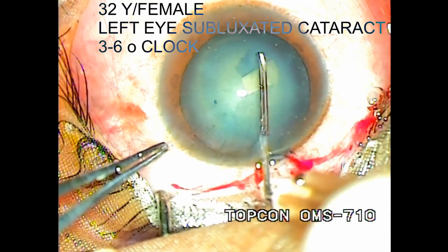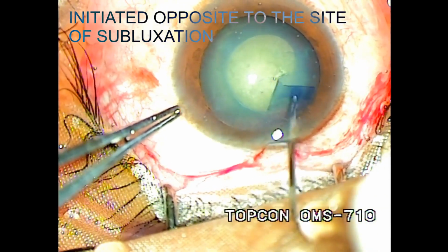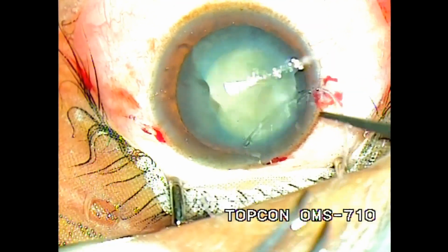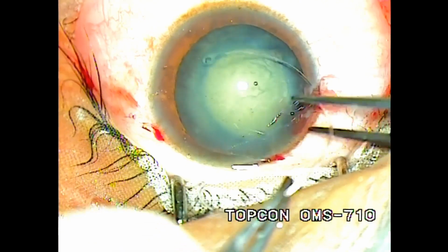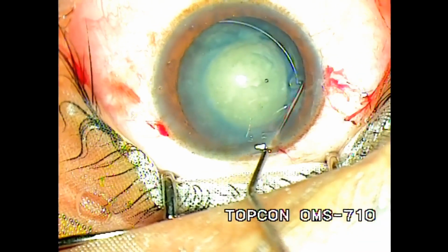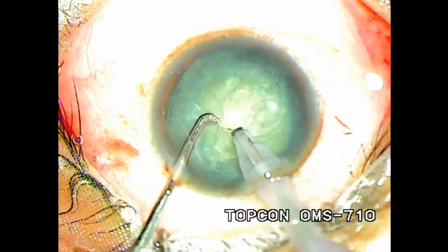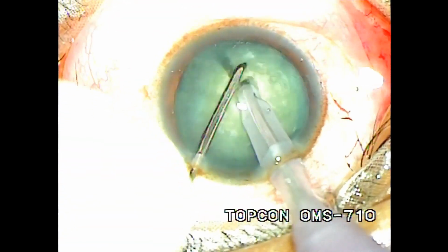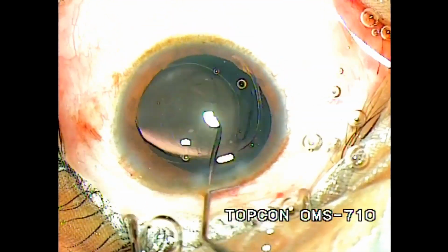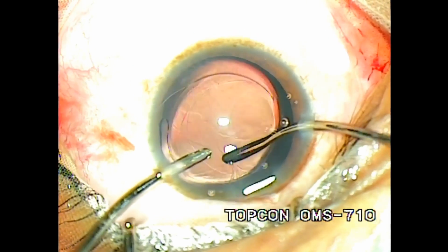This is another cataract patient with subluxation of around 90 degrees undergoing phacoemulsification with the help of a capsular tension ring. Capsular rhexis, as we see, is initiated opposite to the site of dialysis. Once the capsular tension ring is placed, hydrodissection and phacoemulsification are continued as ever before. Capsular support devices aid in the bag placement of the intraocular lens even in the most challenging situations, with good postoperative visual recovery.